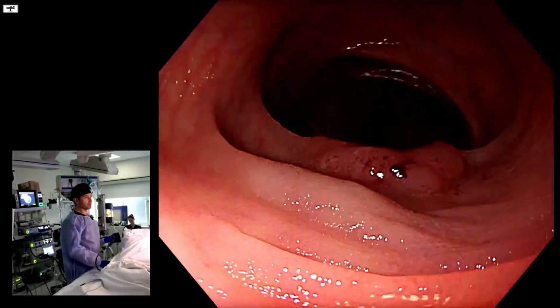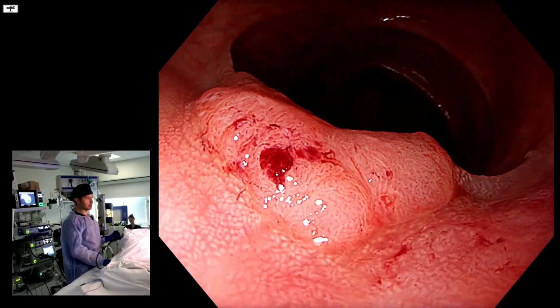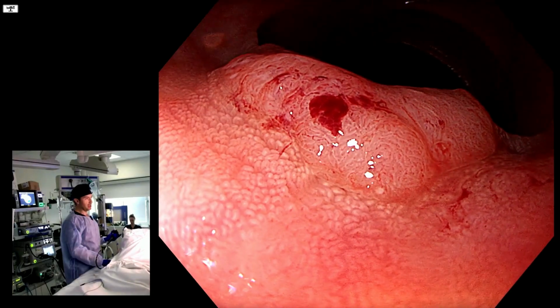So what are we talking about? Well, the position is not so easy. I took the cap off. I would normally have a cap on so I can show you better. So let's start with chicken skin mucosa. Underneath the polyp at the 6 o'clock of the image, this is patches, white speckles within 10 millimeters, I would say, of the polyp surrounding it. And you can very clearly see them here.